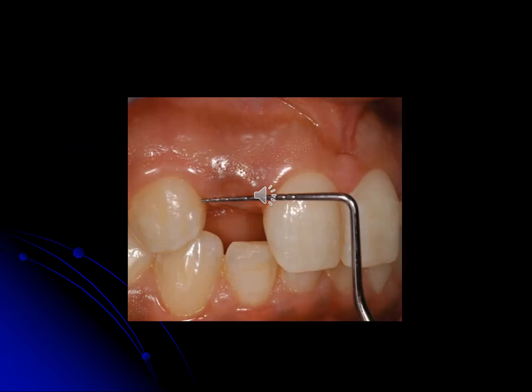As you see, we are measuring the mesiodistal dimension of the edentulous area of the missing tooth cervically, and we should measure this dimension in the area of the tips of the crowns of the adjacent teeth and in the maximum contour of the crowns, that means in the middle part between the cervical and the tips of the crowns.